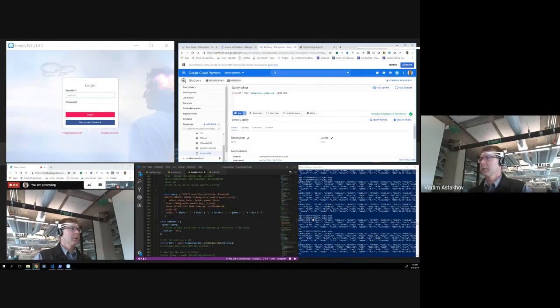So let's see how it did in training. If you can see, this shows the duration that I spent to train the model and how well it actually predicts. I trained this model for several mental activities: when I'm thinking about jumping, moving left, moving right, or shooting. Essentially I would like to control my game, with activities like moving my actor left, moving my actor right, letting my actor jump, or using the weapon. So that's the model.